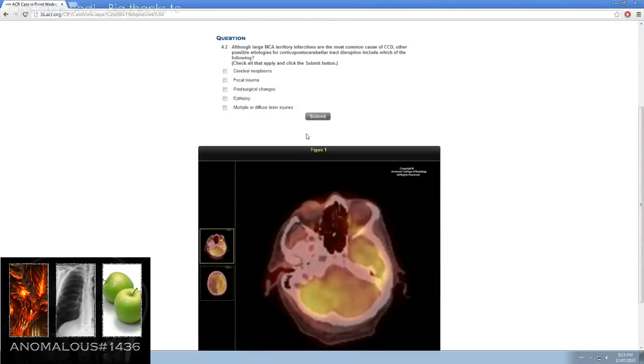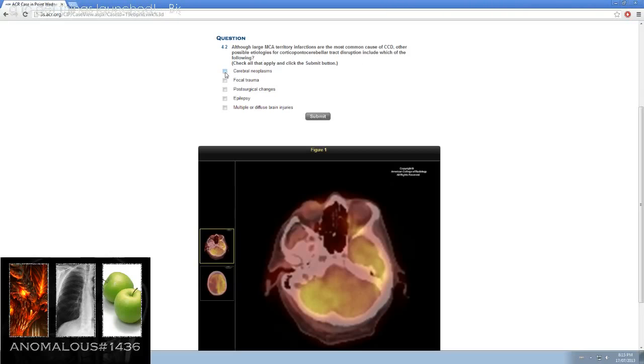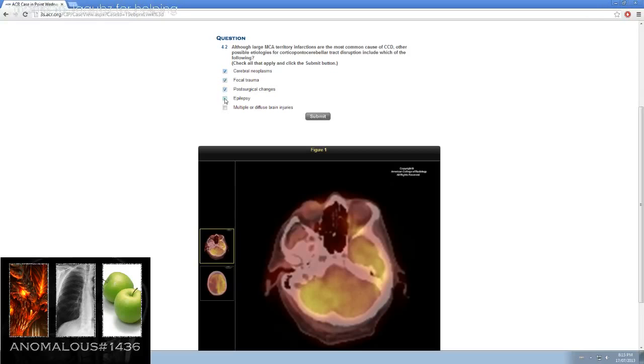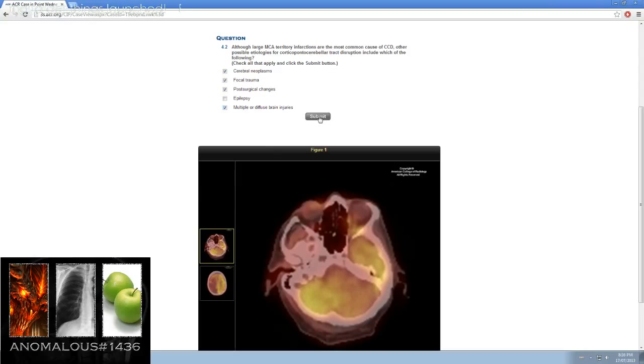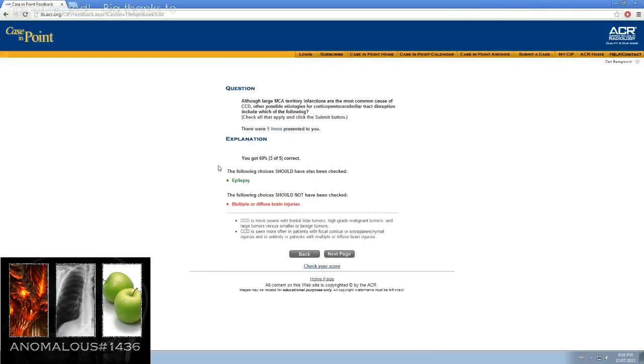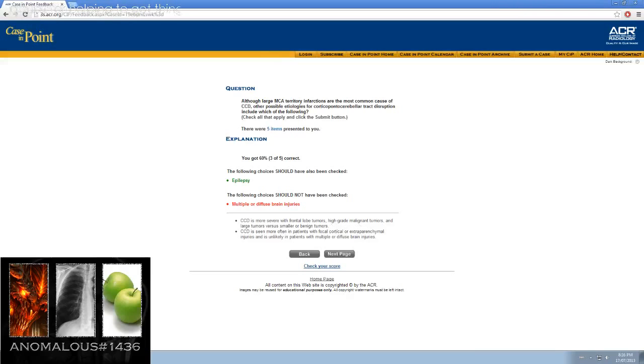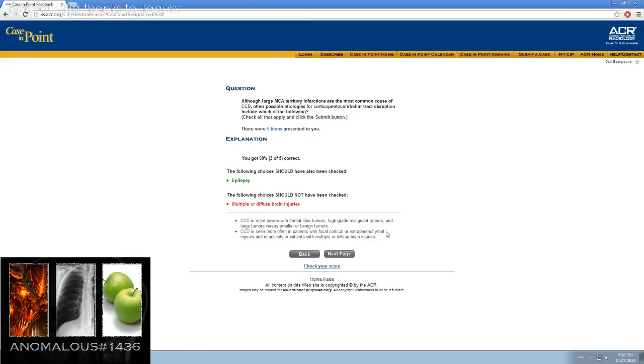Although large MCA territory infarctions are the most common cause of CCD, other possible etiologies for cortical pontocerebellar tract disruption include which of the following. Certainly that's a possibility. Focal trauma, not necessarily, it's possible. Epilepsy, I understand usually affects hippocampus, why would you go with these? CCD is more severe with frontal lobe tumors, high-grade malignant tumors, and large tumors versus smaller benign tumors. CCD is seen more often in patients with focal cortical or extraparenchymal injuries and is unlikely in patients with multiple or diffuse brain injuries.